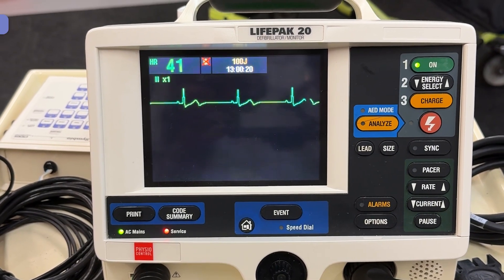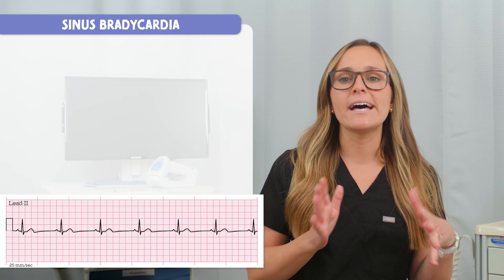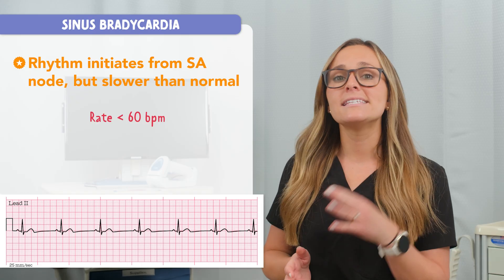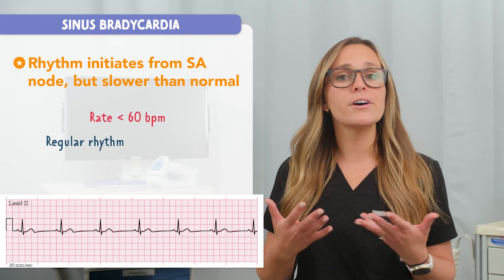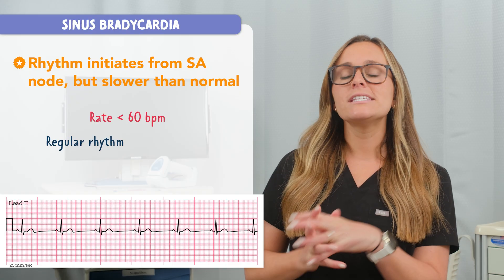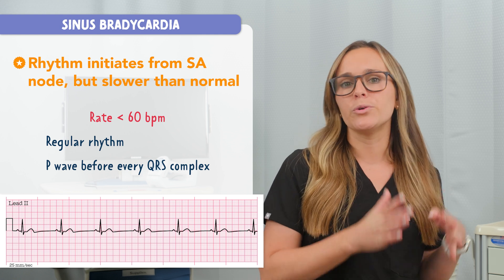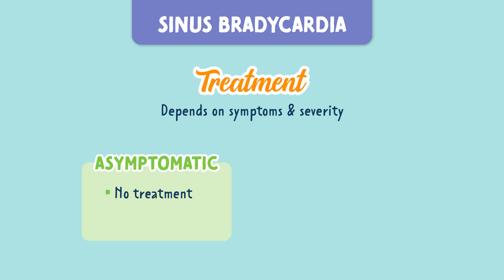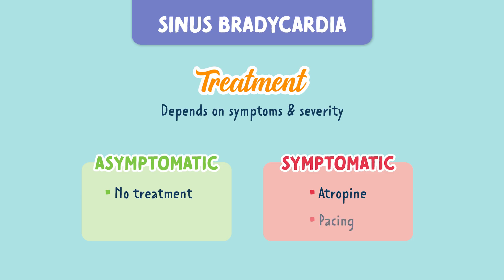This is sinus bradycardia, a rhythm that comes from the SA node but slower than normal. The heart rate is less than 60 beats per minute, but the rhythm is still regular, and you'll see a P wave before every QRS complex. If the patient is asymptomatic, we typically don't treat it — some people, like athletes, naturally have a lower heart rate. But if they're symptomatic — think dizziness, hypotension, or chest pain — we treat it with atropine first, and if that doesn't work, we consider pacing.